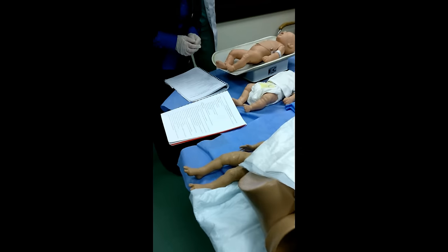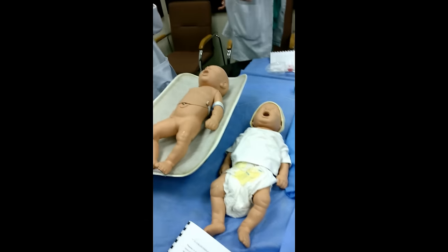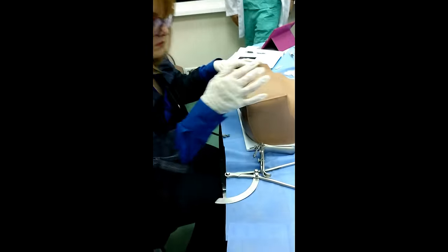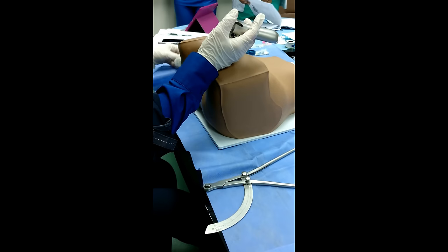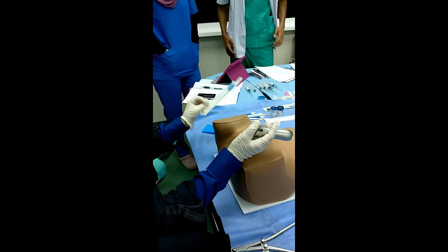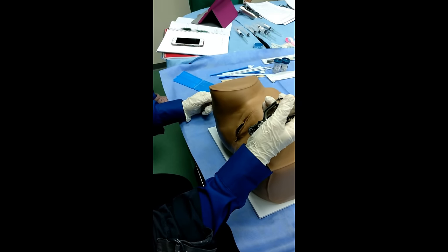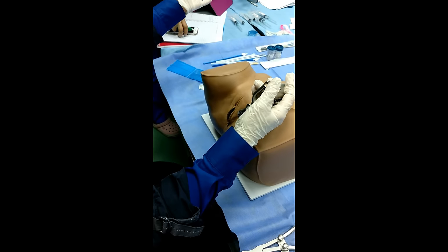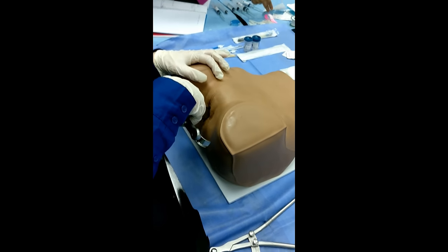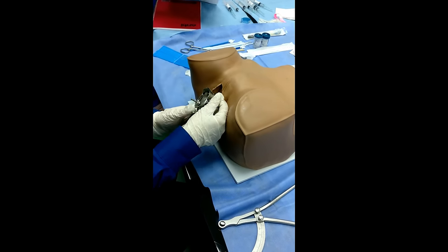Bacterioscopy. Collecting the material for bacterioscopical exam and conventional cytological exam, or cytology in liquid medium. For bacterioscopical exam, we need glasses. For bacteriological culture, we need a medium for culture. Speculum. We disinfect the vulva with antiseptic solution. After that, we insert the speculum, we open it and we fix it.